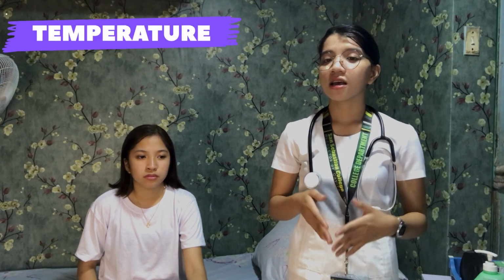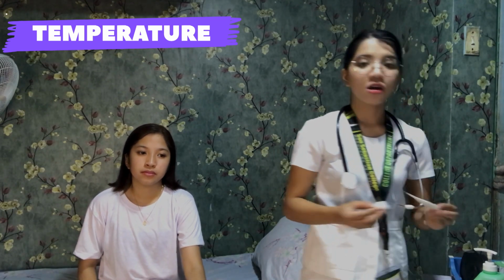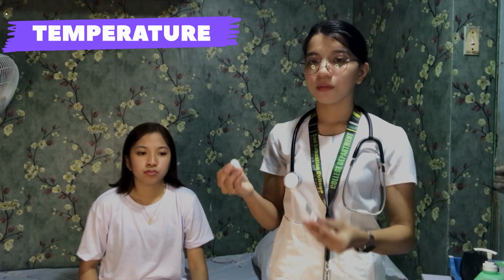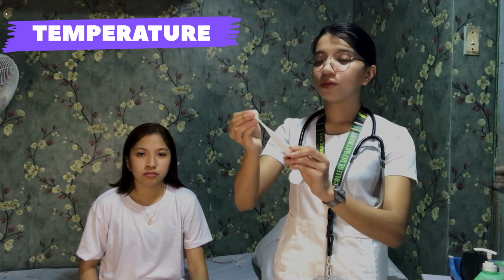Before putting the digital thermometer on the patient, we must disinfect it first by wiping it with an alcoholized cotton ball. So now I'm going to disinfect the digital thermometer. To disinfect it, we start from the bulb to the stem.